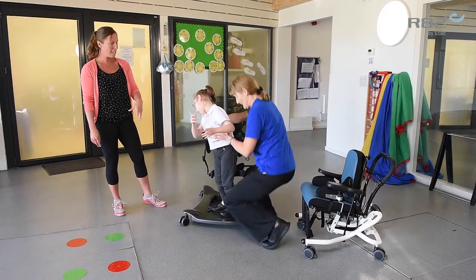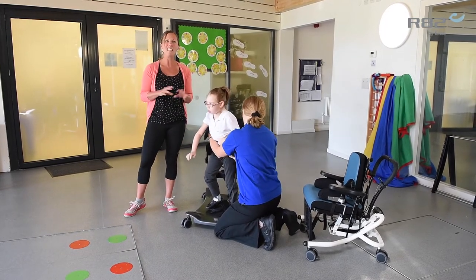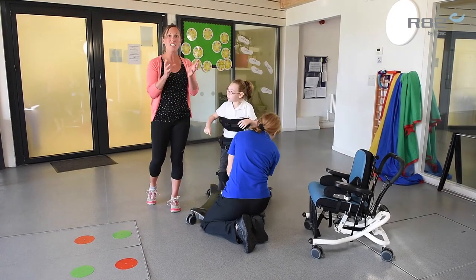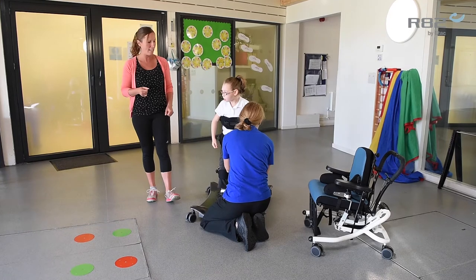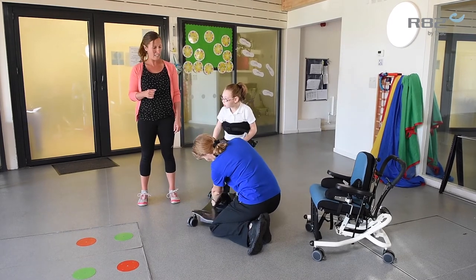A nice turnaround, nice and simple, and we can get those feet into the sandals. And they help locate the feet and give that bit of stability to transferring in. Once you've used the ratchet system, it can be your therapy hand. So you can de-rotate any alignment at the pelvis or at the chest to get nice body alignment, which is what we want in the sandals. Nice and easy with the knee supports as well to correct that, to keep that knee in position. And then foot straps should you need it.